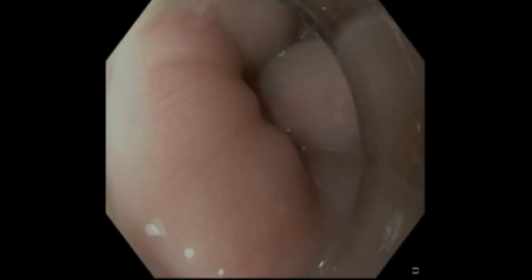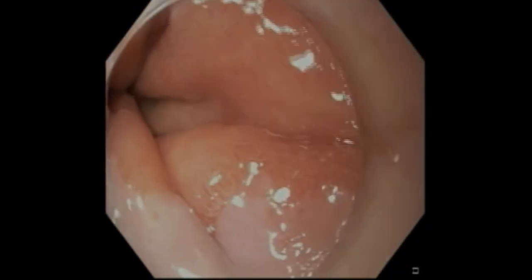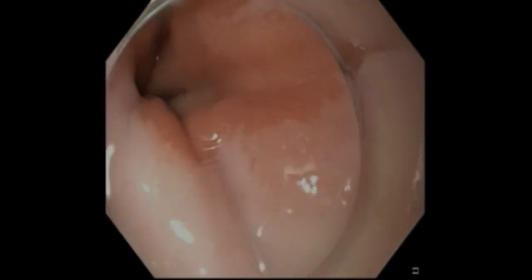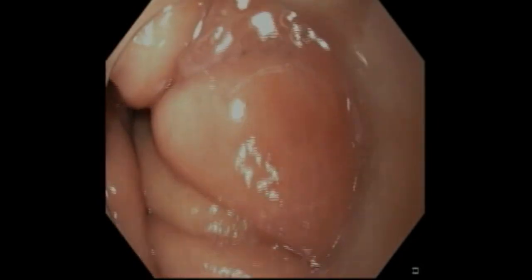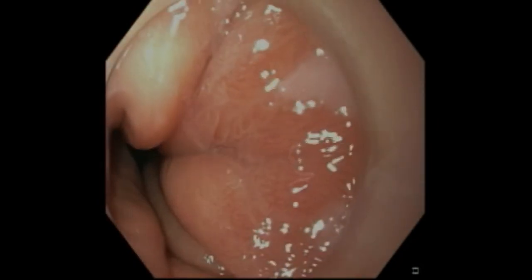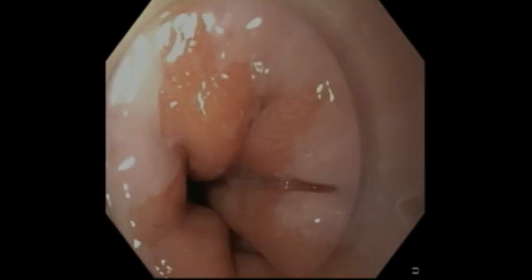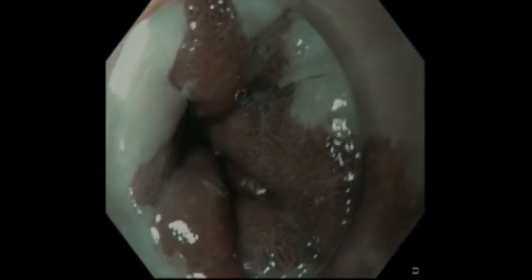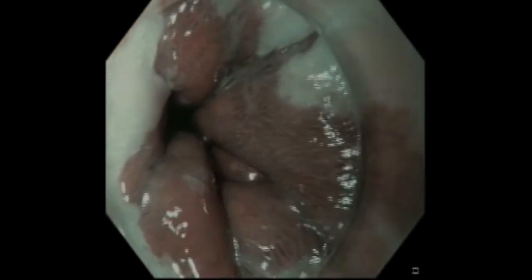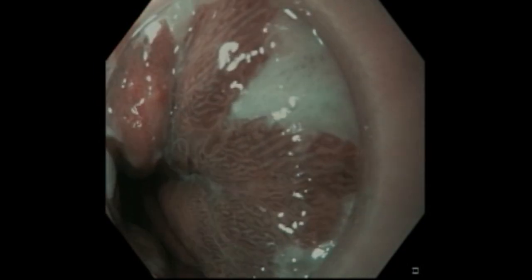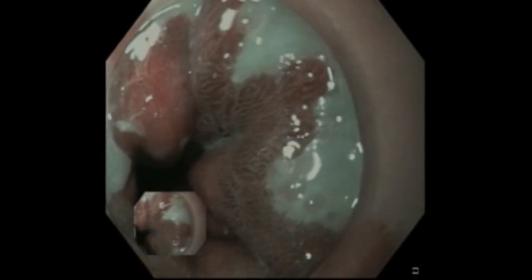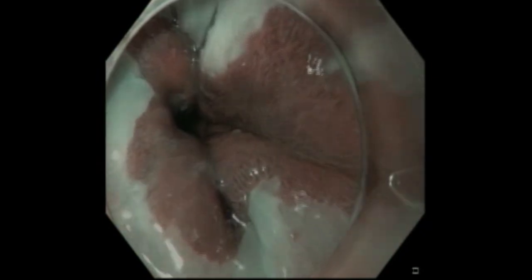Here an endoscopic view is shown, showing early dysplasia on the right-hand side of the screen. It's characterized by a more red and irregular surface pattern shown in the three o'clock position. This area is somewhat broad and may require multiple areas of adjacent resections to completely remove.